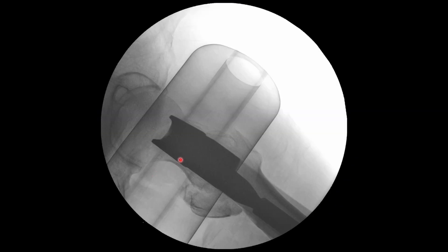What we desire is for the screw to be going centrally toward the center or slightly posterior, and we want the aiming arm of the zig to be perfectly central over the femoral neck.